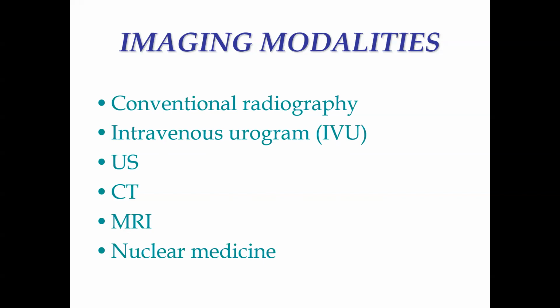And the time when it is needed is going to be the trauma cases, because in cases where the patient is bleeding inside, or there's a trauma or fracture or a visceral injury, then we need to have immediate information. So we are going to save time; for that, we cannot depend on MR, because MR is going to take more time. And it's not easily available in the ER setting. So whenever we have a trauma case, remember, investigation of choice is going to be CT. Why? Because it's going to give you all information about visceral injury, about fractures, about internal bleeding, whatever information.